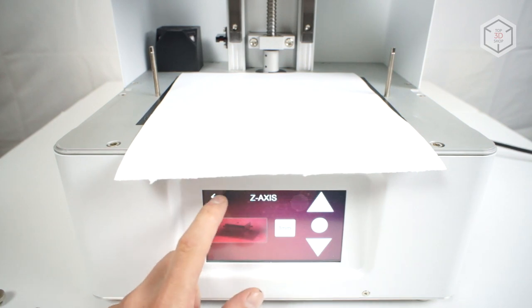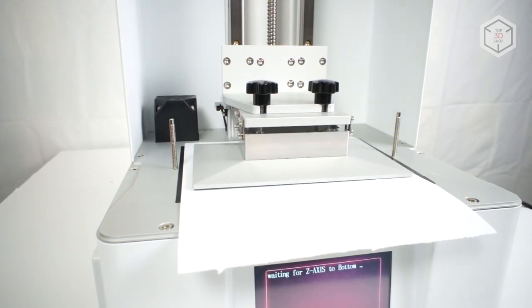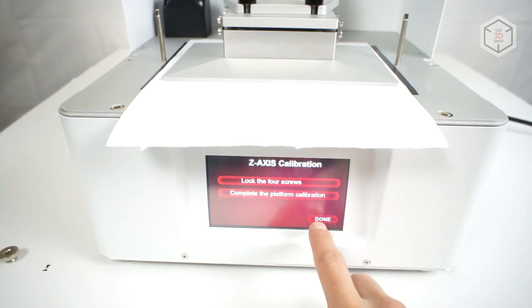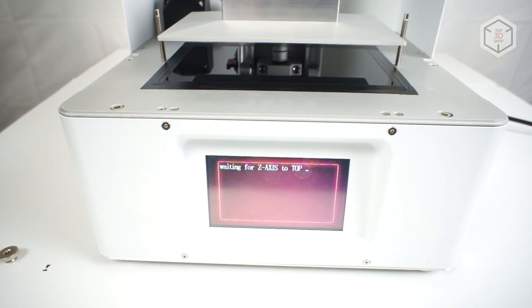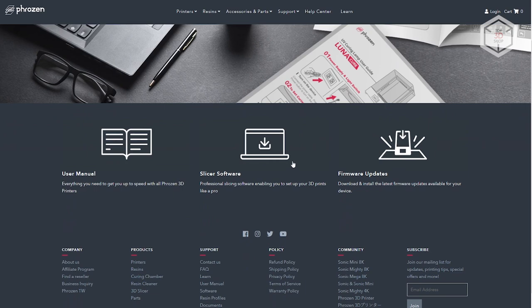Go to the Z-axis in the printer's menu and click on the circle between the arrows. The platform will lower down to the bottom. Tighten the screws, gently pressing the platform against the sheet of paper. After that, tap Next and the platform will rise up. The calibration is complete. There are several options for preparing models for printing.